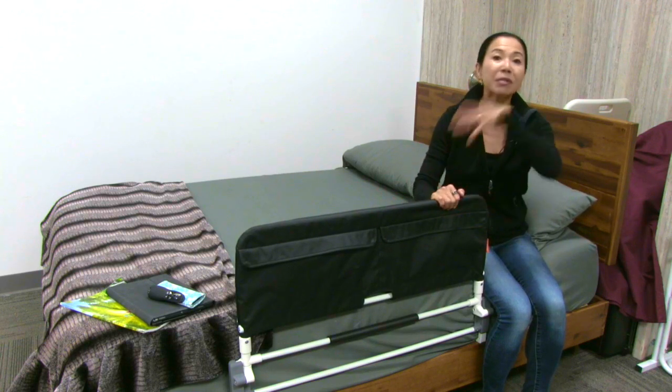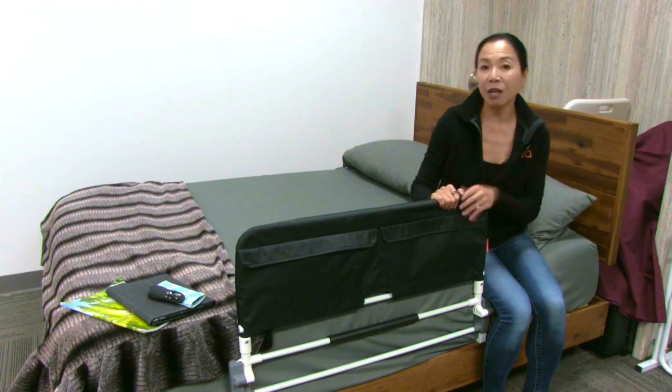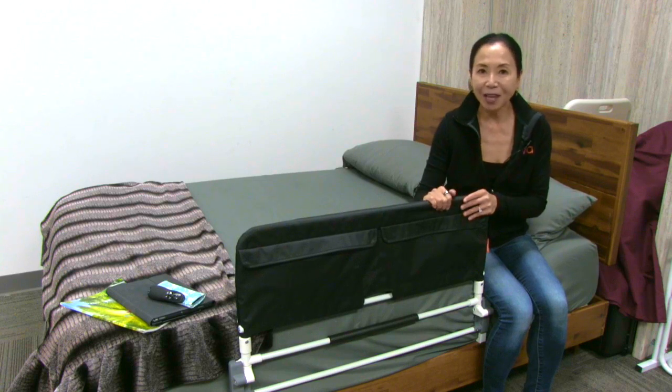Bed rails also help when someone's in bed — say they're reaching for something or grabbing something. That's when a lot of falls happen as well by accident. These bed rails can prevent that as well.